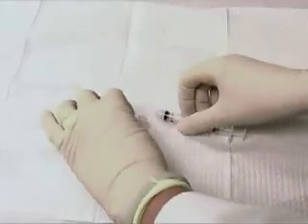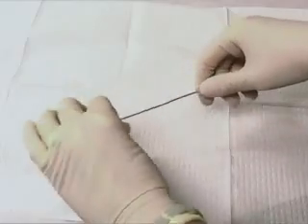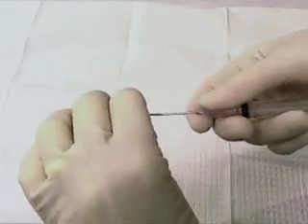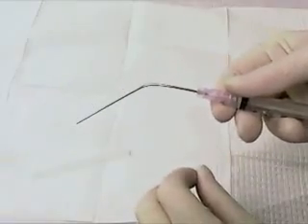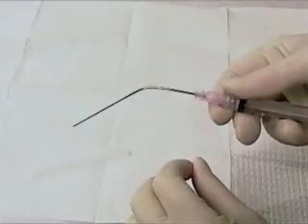If a tympanocentesis aspirator is not available, it is possible to use a 3 milliliter syringe connected to a 3-inch 18-gauge spinal tap needle that is bent at its midpoint to a 30-degree angle. Given the manipulation required to bend the needle and the relatively weaker suction achieved when using a syringe, this is not the preferred method.